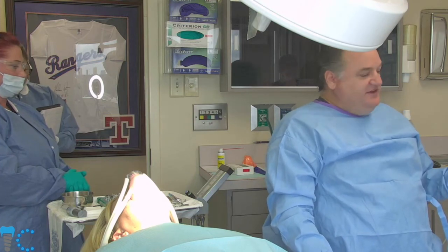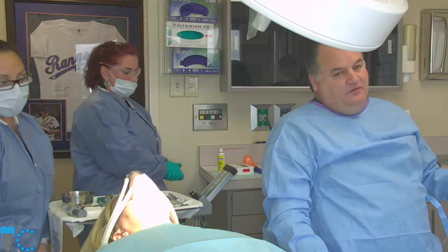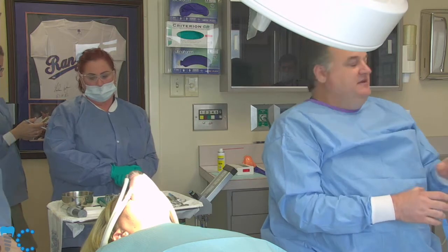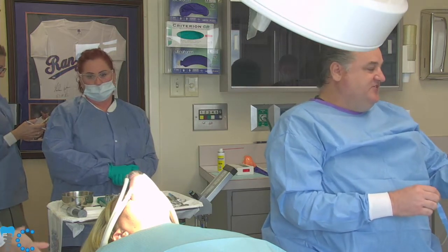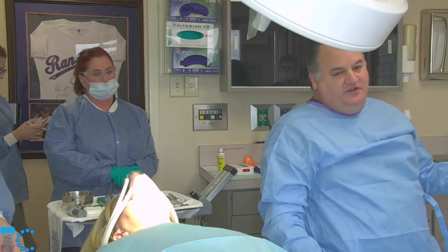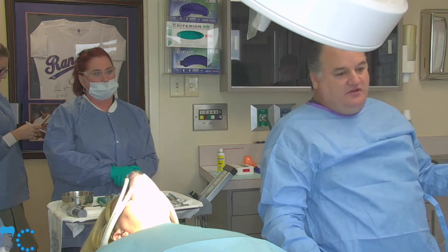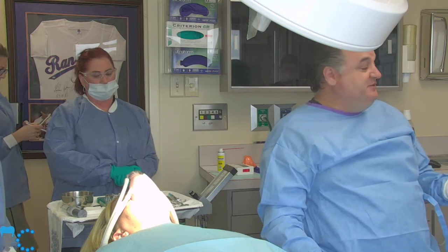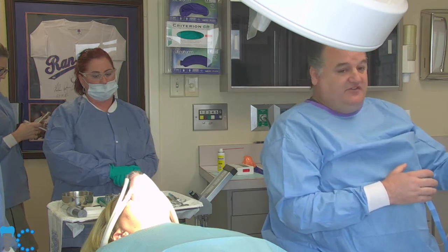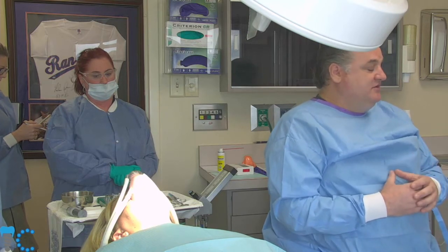So for these implants, when we're doing single tooth restorations, we don't want to torque these more than 30 Newton centimeters. They're ceramic. We don't want to create high shear stresses in small areas. We don't want to do that with any ceramics. But with this one, it gives us no advantage. So to place your implant under high torque is going to cause increased patient pain. It's going to cause it by compressing the bone, and it's going to create an avascular zone further from the body of the implant, and this is going to increase our failure rate.